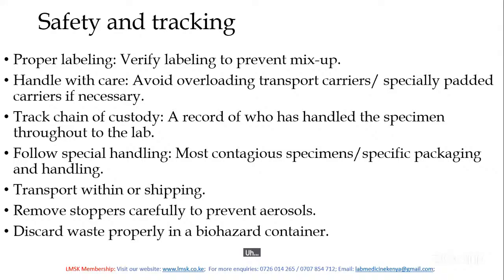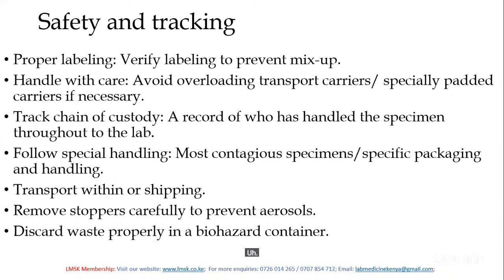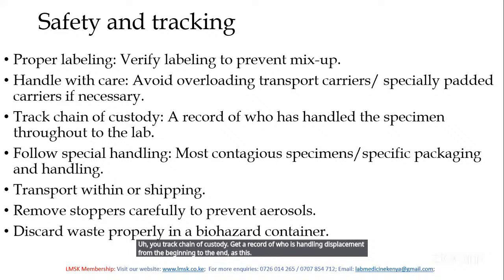Safety and tracking. So after the proper labeling, you verify this, of course, labeling to prevent mix-up. You handle with care to avoid overloading. Avoid overloading transport carriers, or you can use the padded carriers if necessary. You track chain of custody. Get a record of who is handling the specimen from the beginning to the end as it is dispatched.